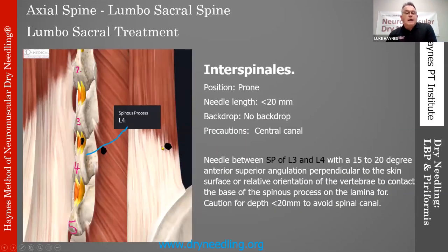The interspinalis, I do needle this from time to time if I've got a patient that just does not seem to be responding to treatment. How functionally relevant is this to movement or to pain and associated dysfunction? Probably not all that significant, but it is a muscle grouping that can be needled, and we do see some results from that from time to time. This is the only area in the spine where you will actually needle from an inferior to superior approach. Given that, we're going to use a smaller needle that's going to be less than 20 millimeters in order to effectively dry needle those two muscles.